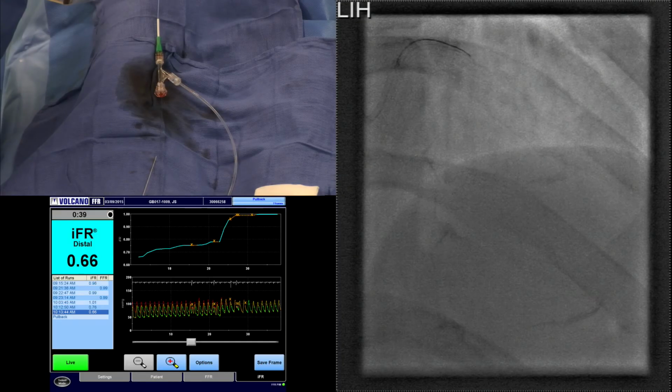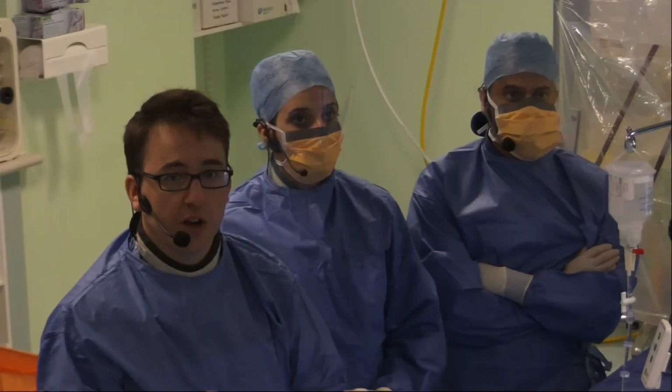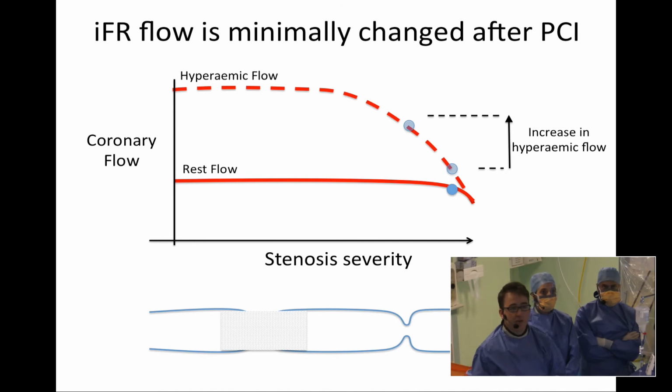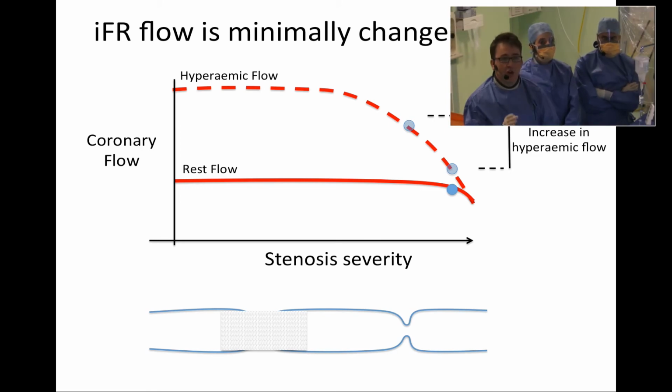The other key thing which I'd just like to warn everyone about, which is very, very important for understanding how this works, and again, if we look back at the physiology slides of the flow, that would be helpful, is that with both FFR and with IFR, we have to, of course, respect the coronary physiology. And you'll see when you come to a stenosis which is 90% or more for both hyperemic measurements or non-hyperemic measurements, that's essentially where that last dot is on both of those two slides there. There you go, thanks very much, Luke.